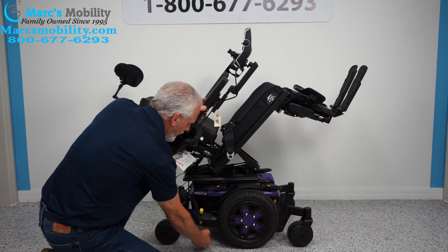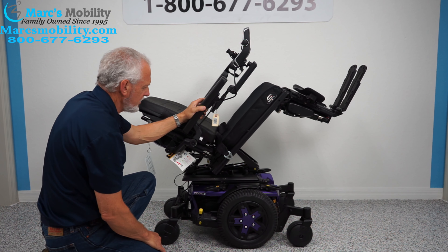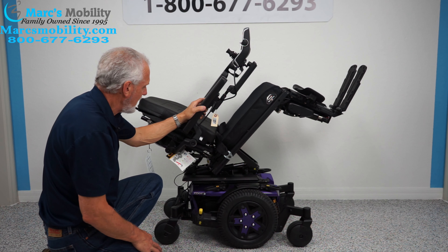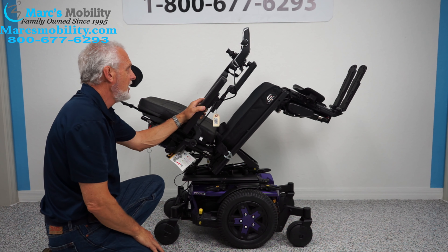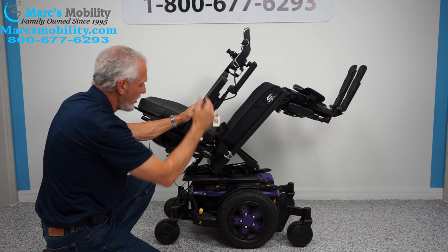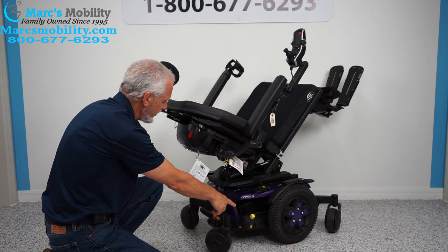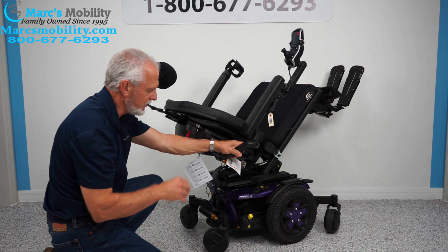You have a motor for each wheel. This chair right now probably weighs around 350 pounds. So if you want to push it, all you have to do is turn the power off — you want no resistance in the motor. The only thing you have to do is push this lever down, and what that does is it unlocks the wheel. You have a motor for each side, so just put them both in neutral and then you can roll your chair around if you had to.